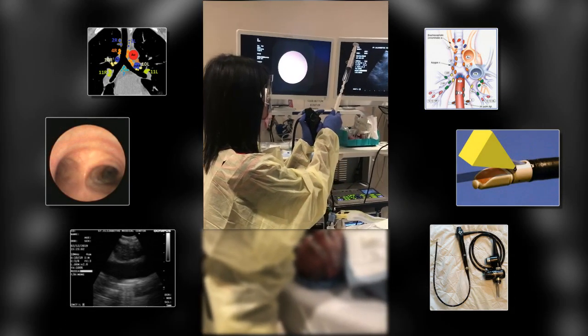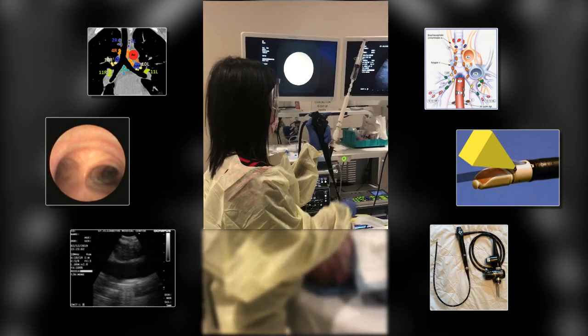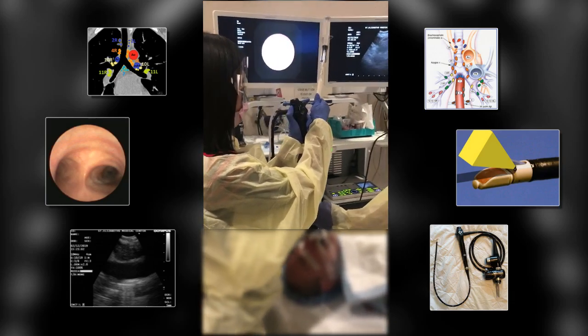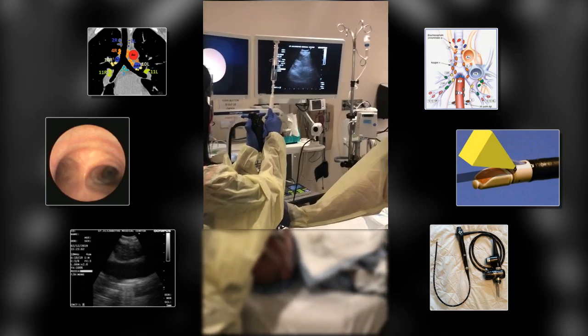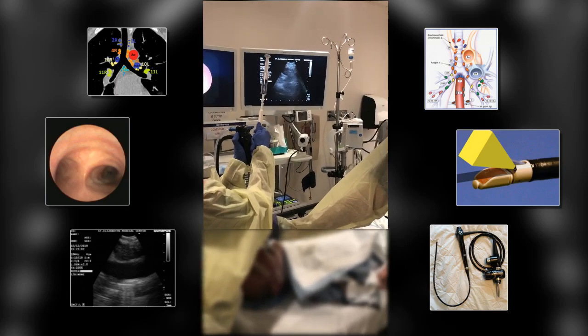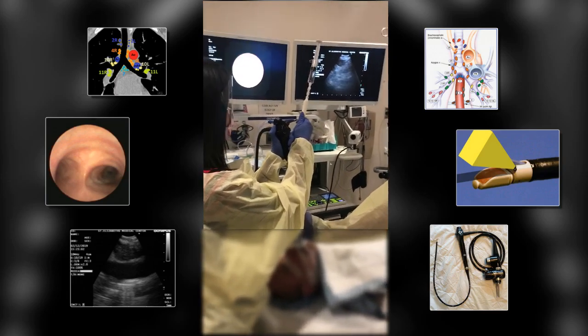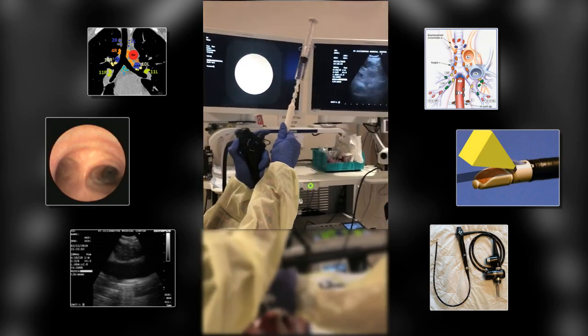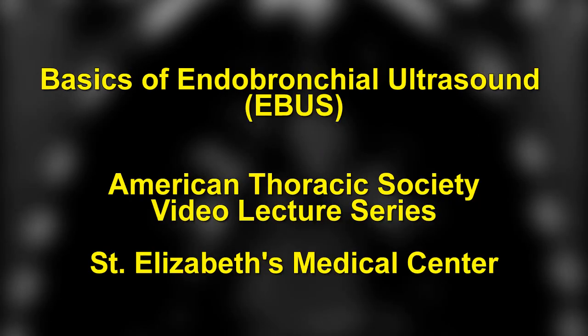In the last decade, Endobronchial Ultrasound Guided Transbronchial Needle Aspiration, or EBUS TBNA, has emerged as the diagnostic procedure of choice in evaluating undiagnosed intrathoracic lymphadenopathy. EBUS TBNA is also currently the preferred modality in the mediastinal staging of lung cancer. The purpose of this video is to review in detail the basics of EBUS bronchoscopy, as well as to highlight the technical aspects of the procedure in order to optimize diagnostic yield for performing clinicians.